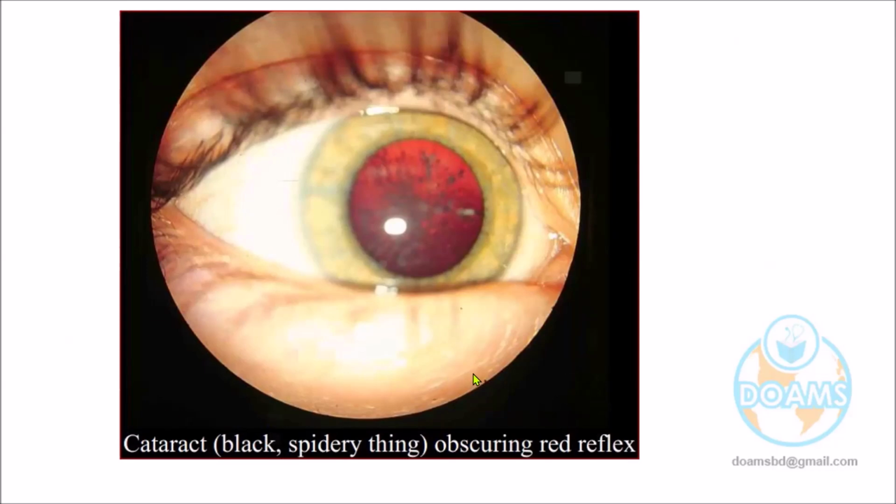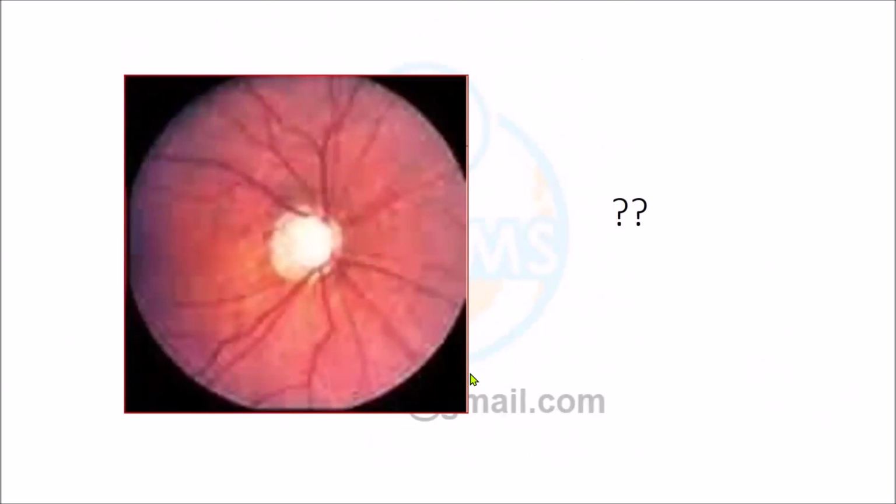Spidery black cataract. Now what you are looking here, please. The more you interact, the more you will learn today, like every day. Cupping of the optic disc is increased. Yes, cupping is naturally there, but it is increased.